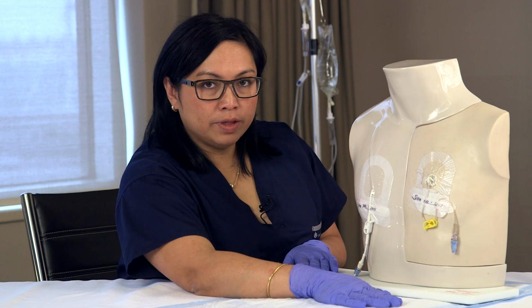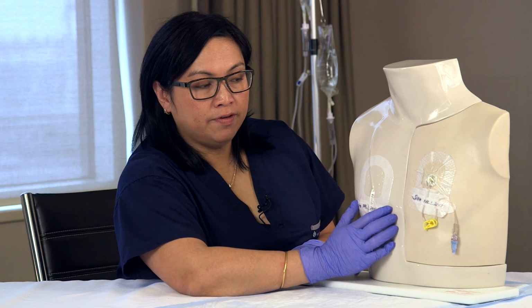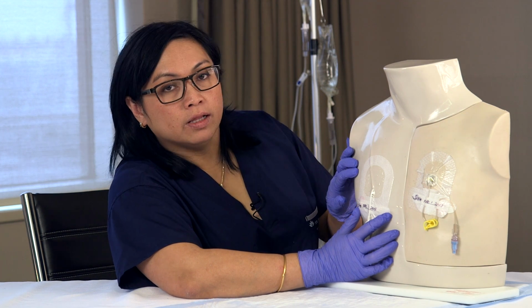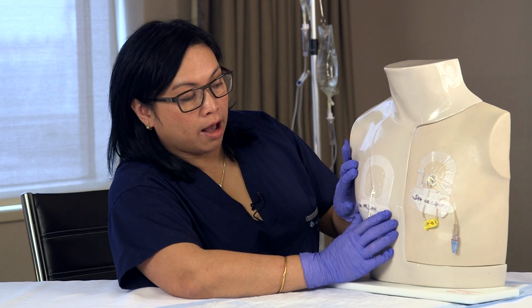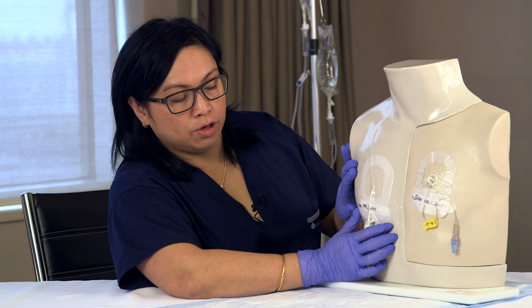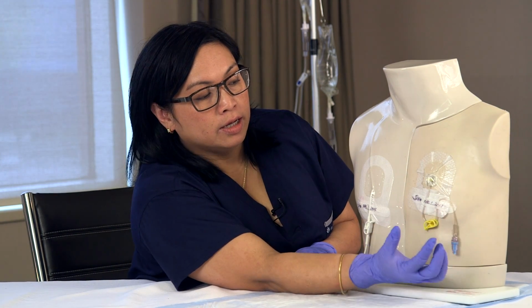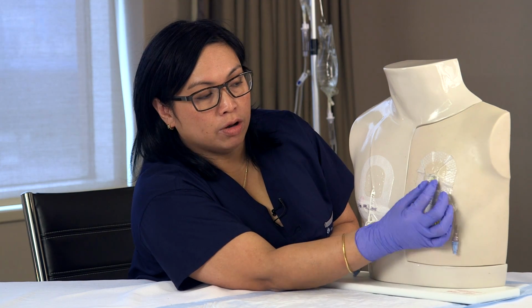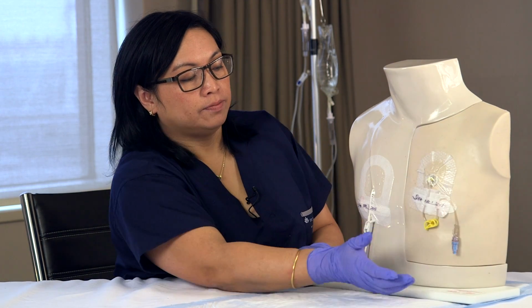Now we are going to go through the assessment of 2 different types of lines that are commonly found on the chest. One is the tunneled CVAD, the other is the implanted CVAD. The tunneled CVAD is typically secured with the internal cuff as well as the securement dressing. The implanted port always has to have a non-coring needle accessed, and that becomes part of our assessment.